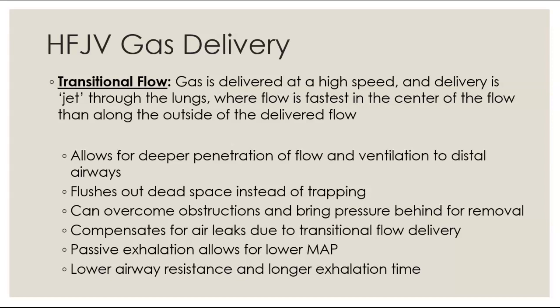This is gas that is delivered at a high speed. So you can think of it as it's jetting through the lungs. It's jetting through any obstruction, jetting through any consolidation, through any collapse, collapsed alveoli, anything like that. So the middle is faster, the center flow is faster, while the outer flow is slower. And I have a diagram on the next slide. Benelli uses the word it squirts to the end of the lungs, and that made me uncomfortable. So I like to think of it as it jets like a rocket to where we need to be, past obstructions, consolidations, anything like that.